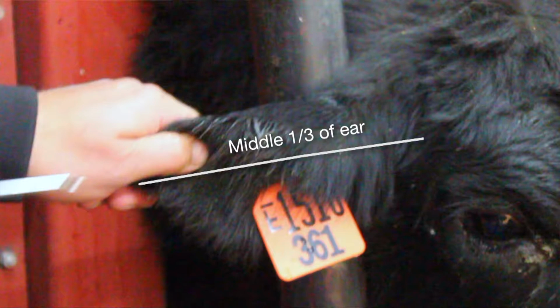If they get too close, sometimes they can get stuck in the cartilage. If they're out towards the tip, if they swing their head, sometimes we can lose those pellets. They pitch the implant. So we want them in the central third of the ear.